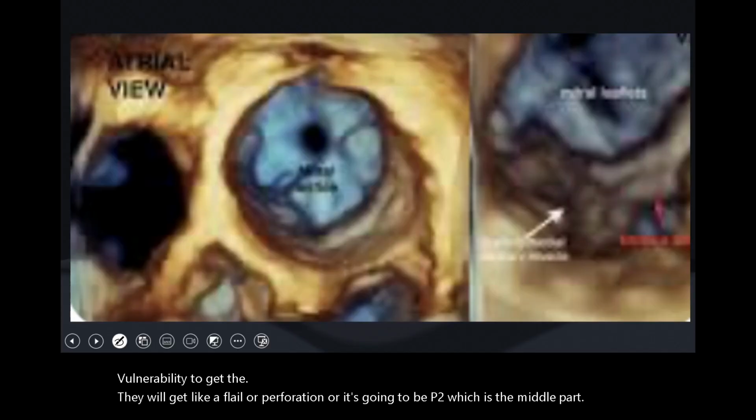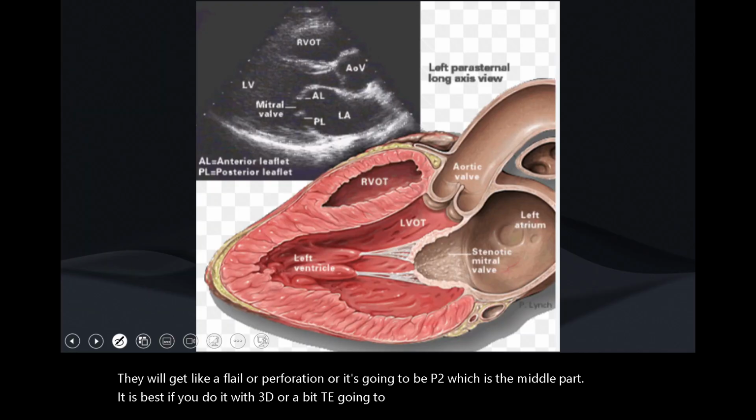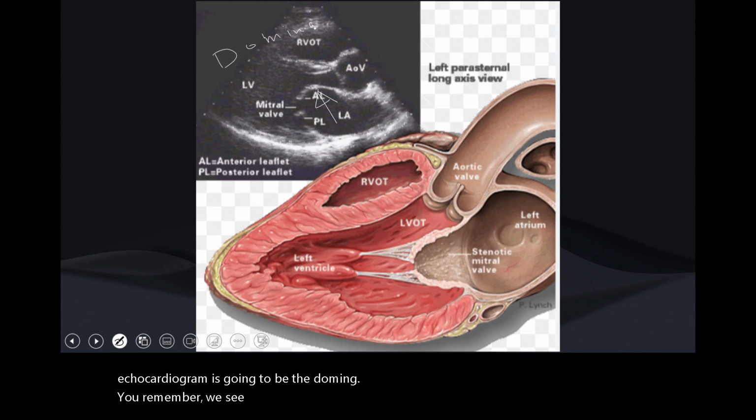It is best if you do it with 3D or with TEE, you're going to get better and closer images. In the first picture, the first thing you can see on the echocardiogram is the doming. You remember we said doming is a characteristic in aortic stenosis with bicuspid valve, right?